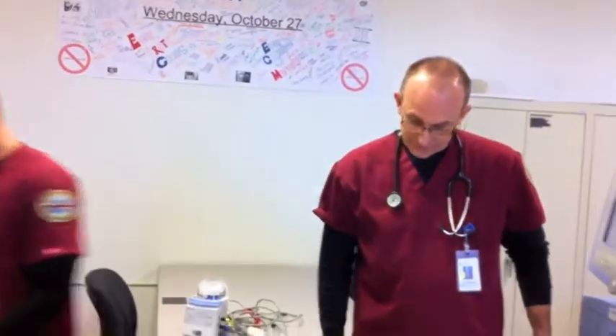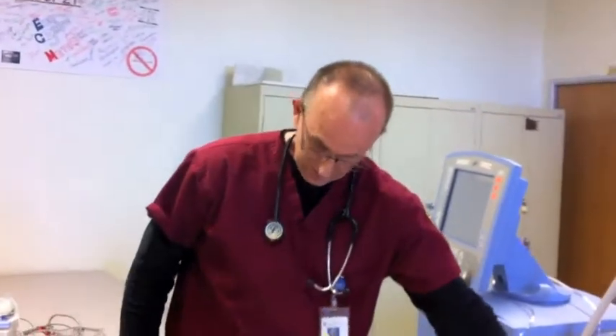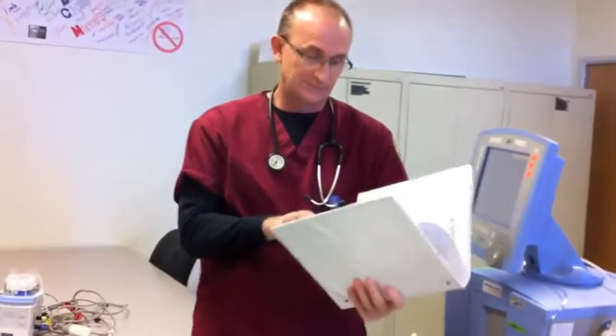This is David Nguyen, and we are doing adult ventilator monitoring. First thing he's going to do is review the patient's chart for history, ABGs, original order for mechanical ventilation, and current ventilator orders.